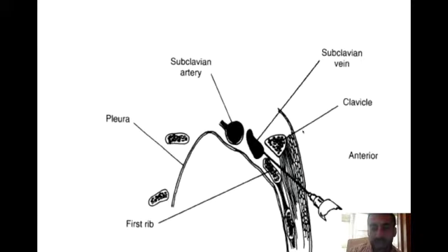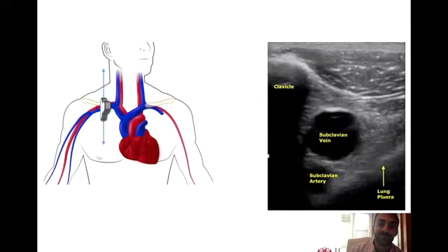This again just showing how we would take with the clavicle, having our needle approach superficially underneath the clavicle as we can, so that we cannulate the vein artery behind that, and not that much further below. We have the lung pleura and the risk for a pneumothorax.